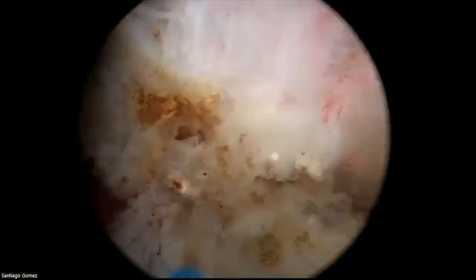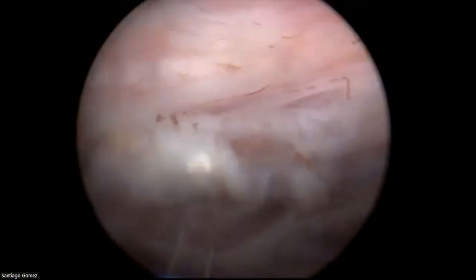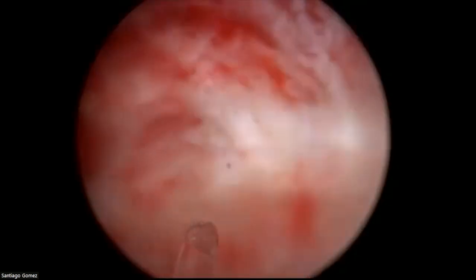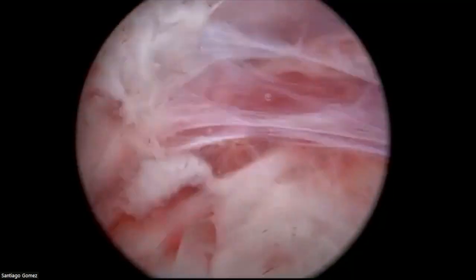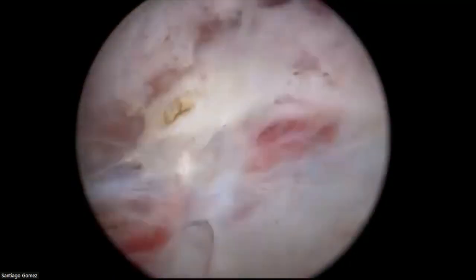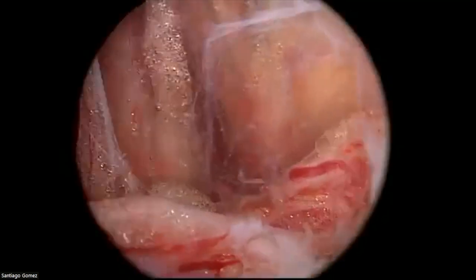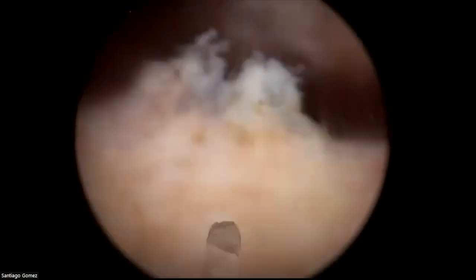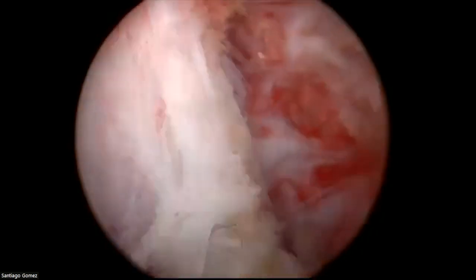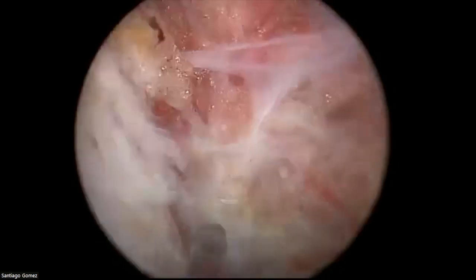So regarding the attitude, as I said, you have to be very relaxed. Sometimes in some areas, you're going to find that the plane looks a little bit deep. Sometimes this could cause some extravasation of water locally, usually of no concern. Here, this is a bigger perforation, I think, and I did this mechanically, not with the laser, maybe in one of my movements. But again, I remain quiet, I remain calm.